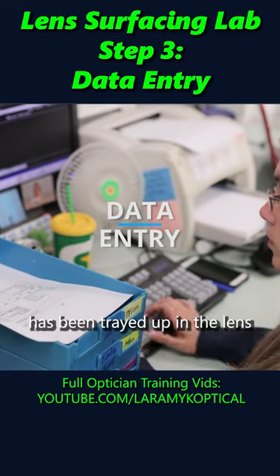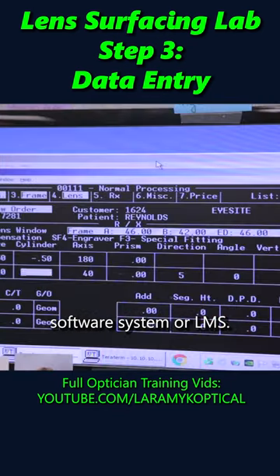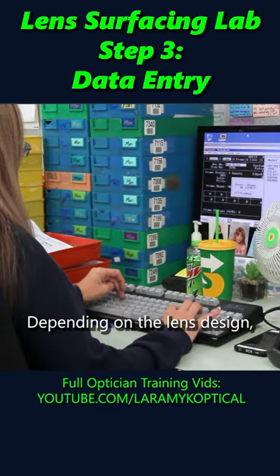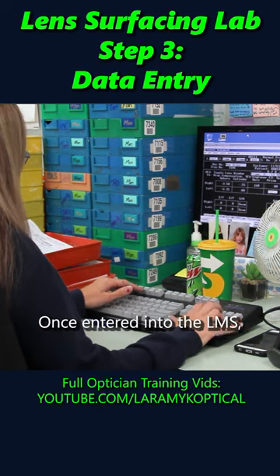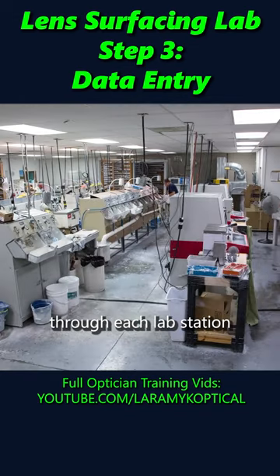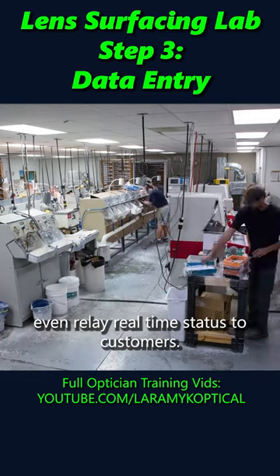Now that the order has been trayed up and the lens blanks have been pulled, it gets entered into the Lab Management Software System, or LMS. Depending on the lens design, the system may require entering 50 data points or more. Once entered into the LMS, this job can now be tracked through each lab station, and in some cases even relay real-time status to customers.